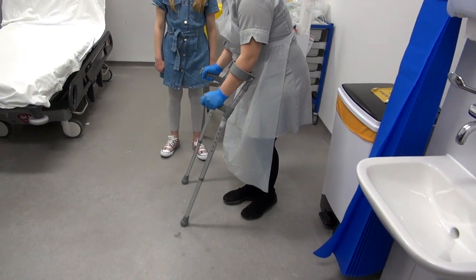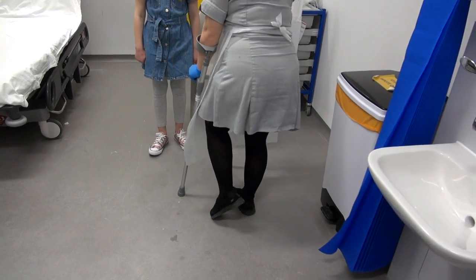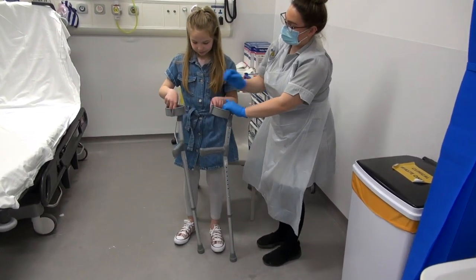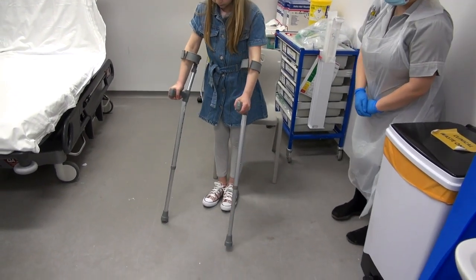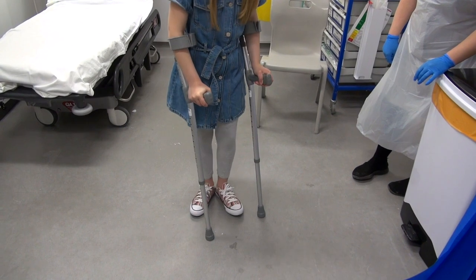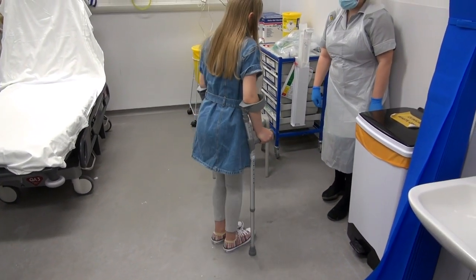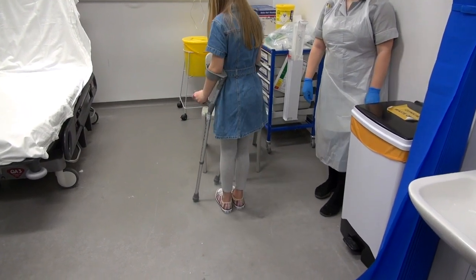When you want to twizzle around, just little baby hops and twizzle on your good leg. Crutches, bad leg, good leg. That's it. Just remember to look where you're going as well.